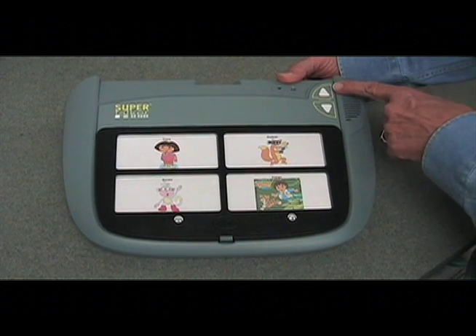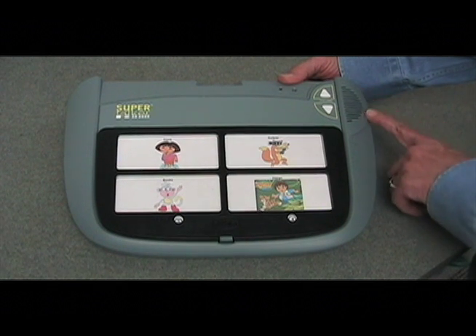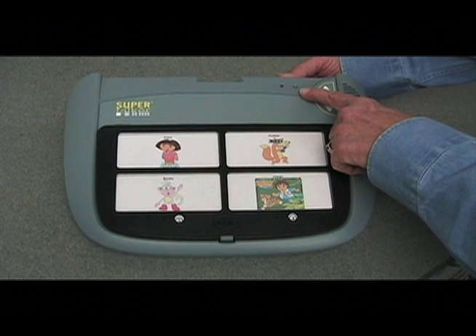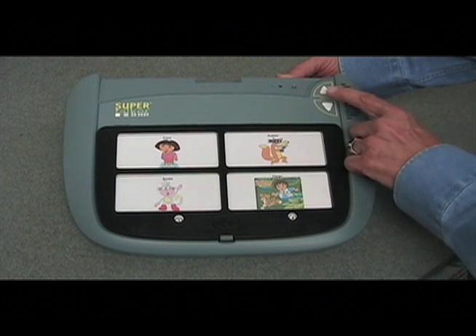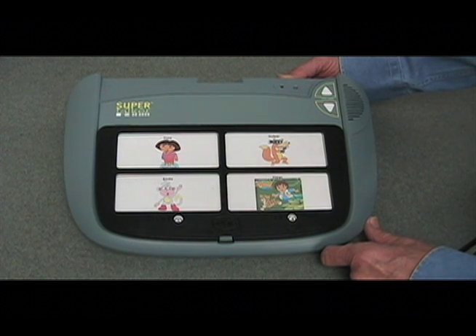We have your volume up and down buttons that are adjusted by touch, and we have the speaker. We have the light that turns red when you are in record mode, and the microphone that you use when you're recording messages on the SuperTalker.